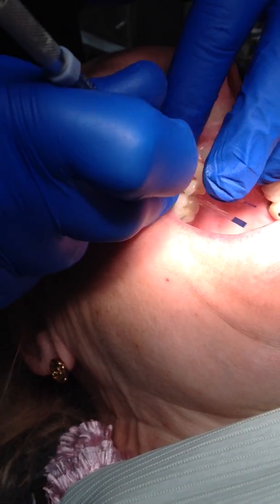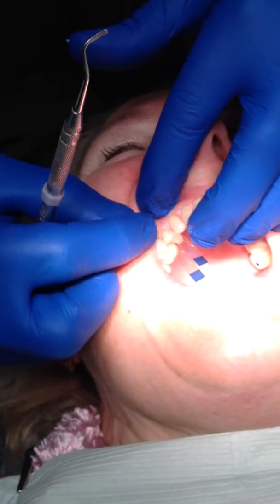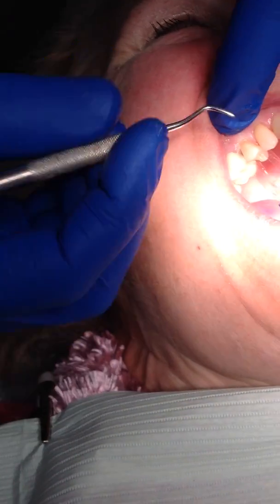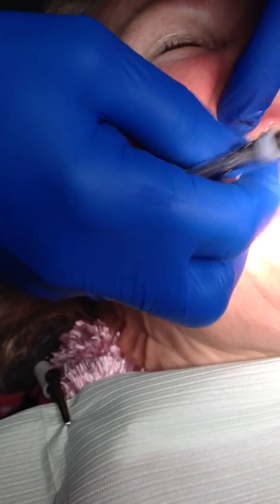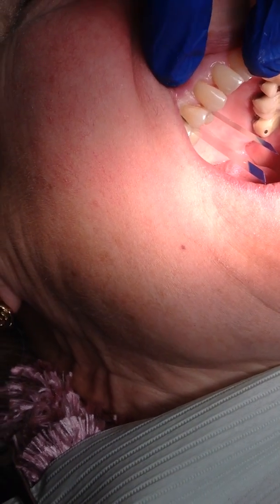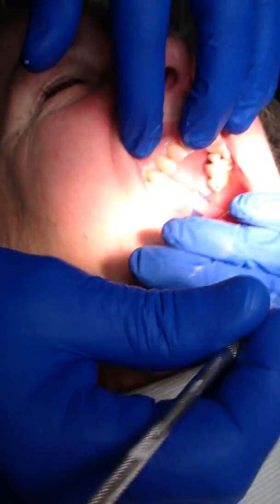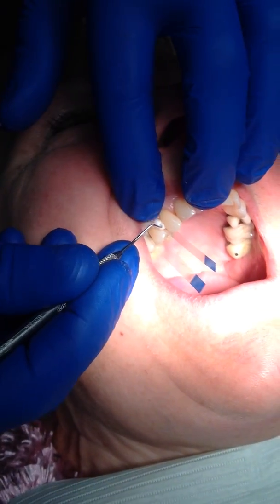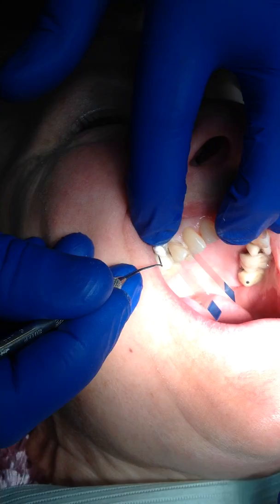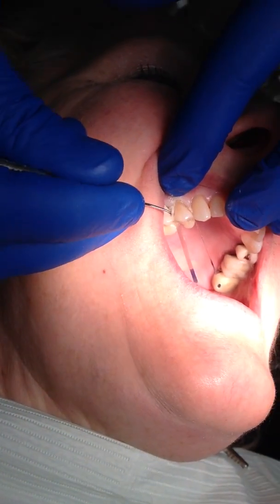Notice that the band is sticking up — it's not going into the mouth, it's actually sticking more up. We take a spoon and pull it over the outside edge of the preparation. And then you'll notice how nicely it adapts to the gingival aspect of this tooth. Where it's not adapting to the gingival aspect of the tooth is interproximally. So what we do is take a little cotton ball and push it into the interproximal area.